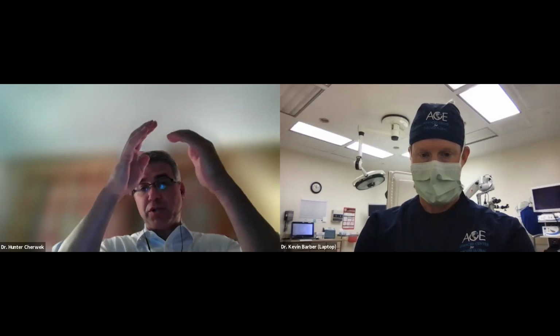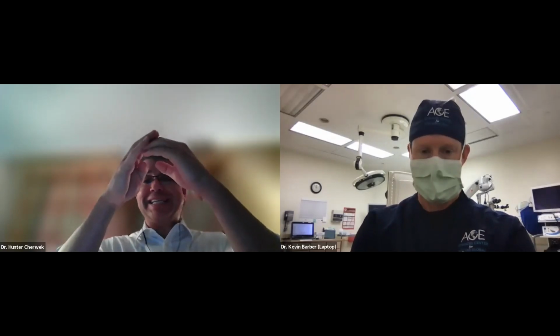And I think that's a great point, Kevin. Certainly blood can obscure the view, but it can also tell you that you are where you need to be. And you talked about the tactile feel. That is why the KDB is a single-use device: blood cells or trabecular meshwork cells can get in that pocket of the knife and never be able to be cleaned out. So it is certainly a single-use device, but also you want the sharpest instrument, so that you have that tactile feel and know exactly where you are and how much pressure you should be applying.